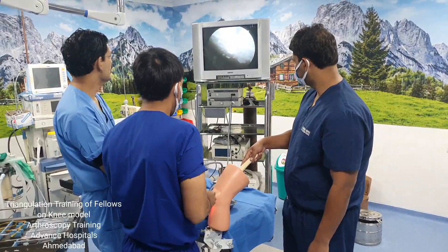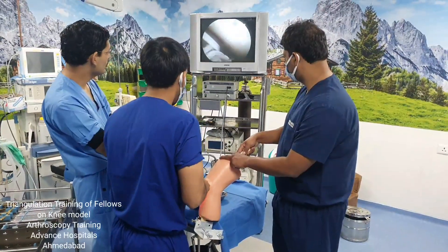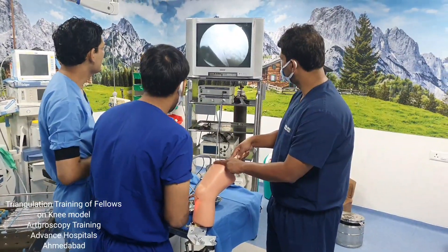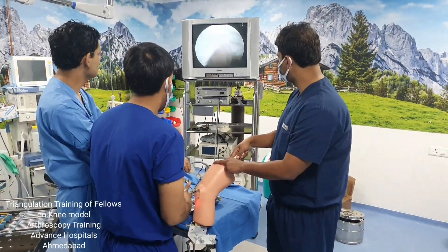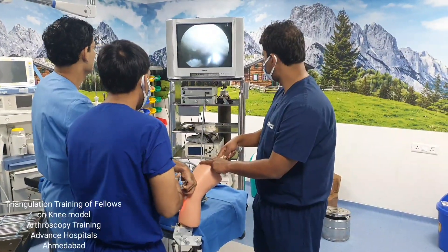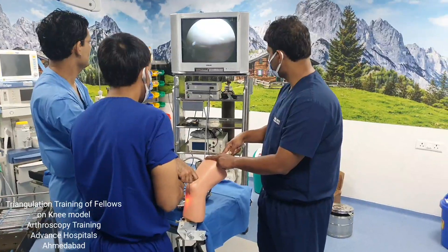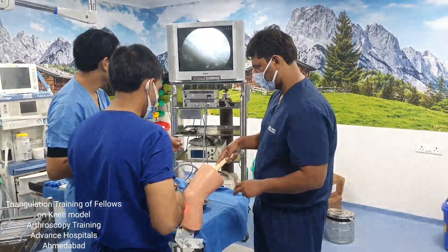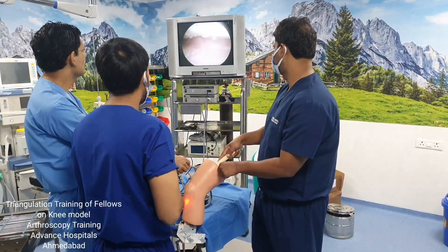You can see this is the cartilage region and this is the loose body that we want to remove. You can use your arthroscopic grasper to remove these small loose bodies. Take it a little bit posterior, open your grasper, hold the loose body and take it out. You can see that the small loose body has been taken out successfully — this is practice you can do on this model which you cannot do on a live patient.